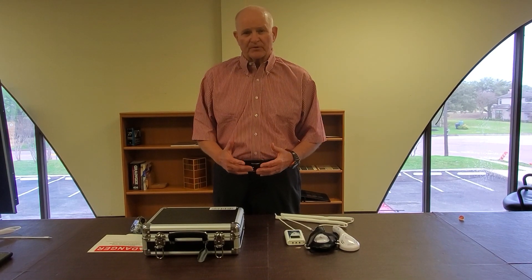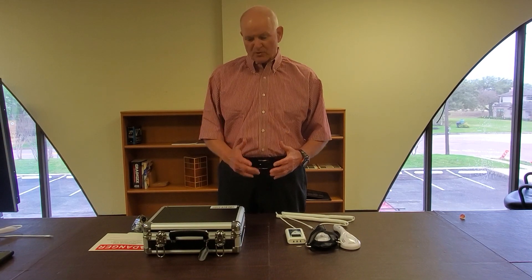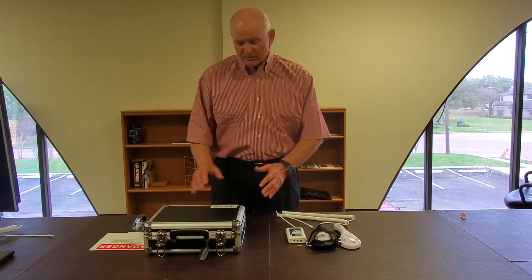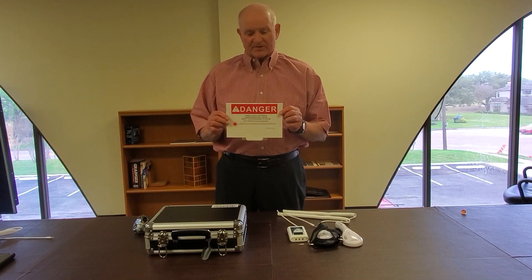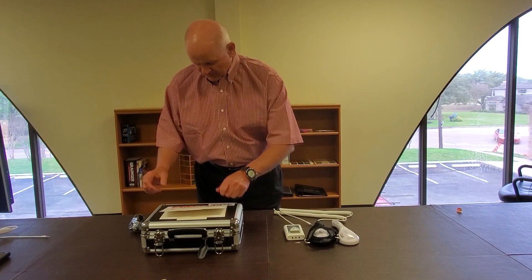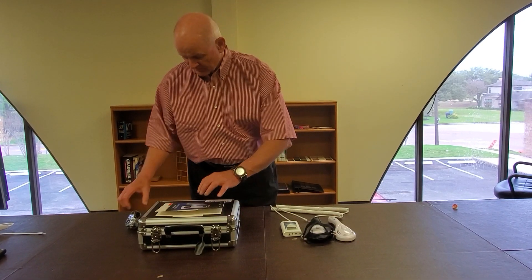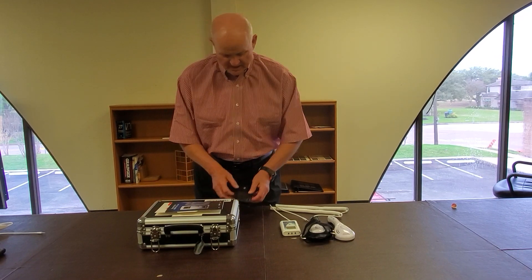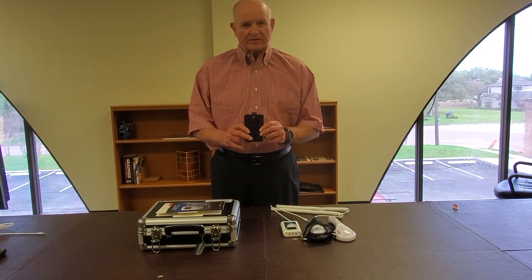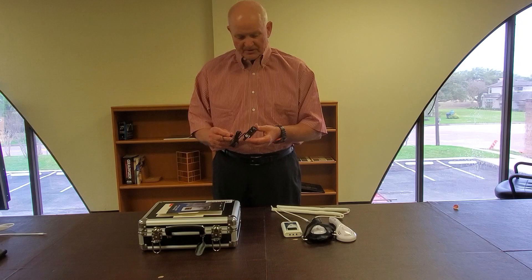Good afternoon. My name is Mike Barber and I'm going to go through an in-service this afternoon on our new smart laser utilizing the two laser probes. The first thing you do is open up your case, and what you'll find is a danger label sign for your office, the operating guide, a pair of glasses, laser goggles, a holder for the console itself, and a recharging unit for the console.